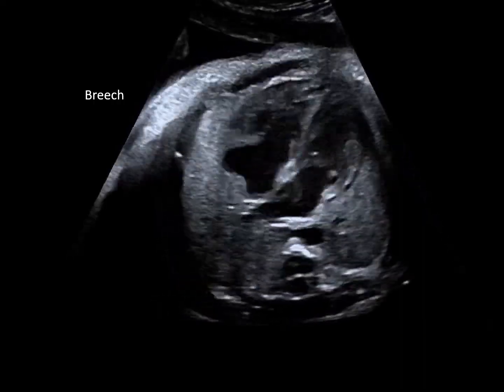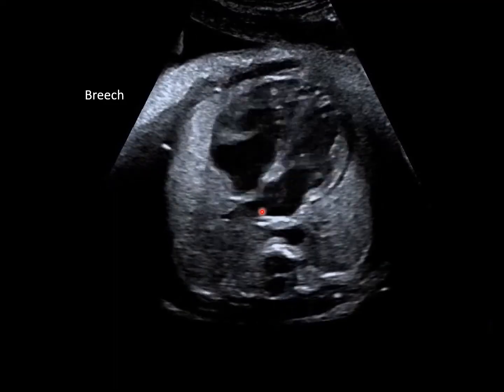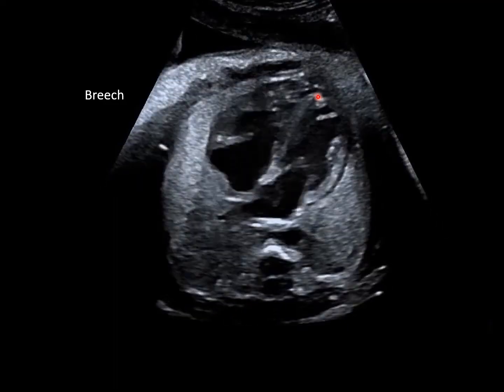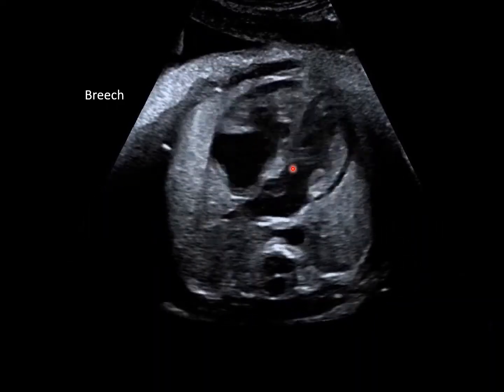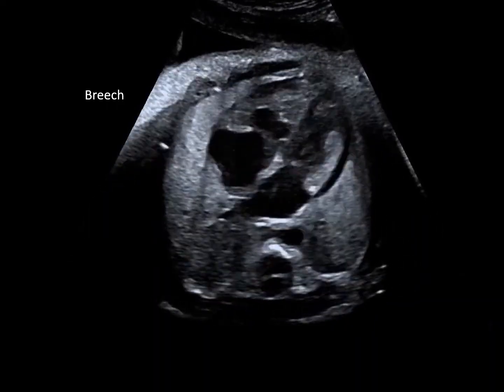In this example, you can see the entire cardiac long axis, from back here the left atrium where the pulmonary veins come in, all the way through the crux of the heart down to the apex. Perfect example of that.